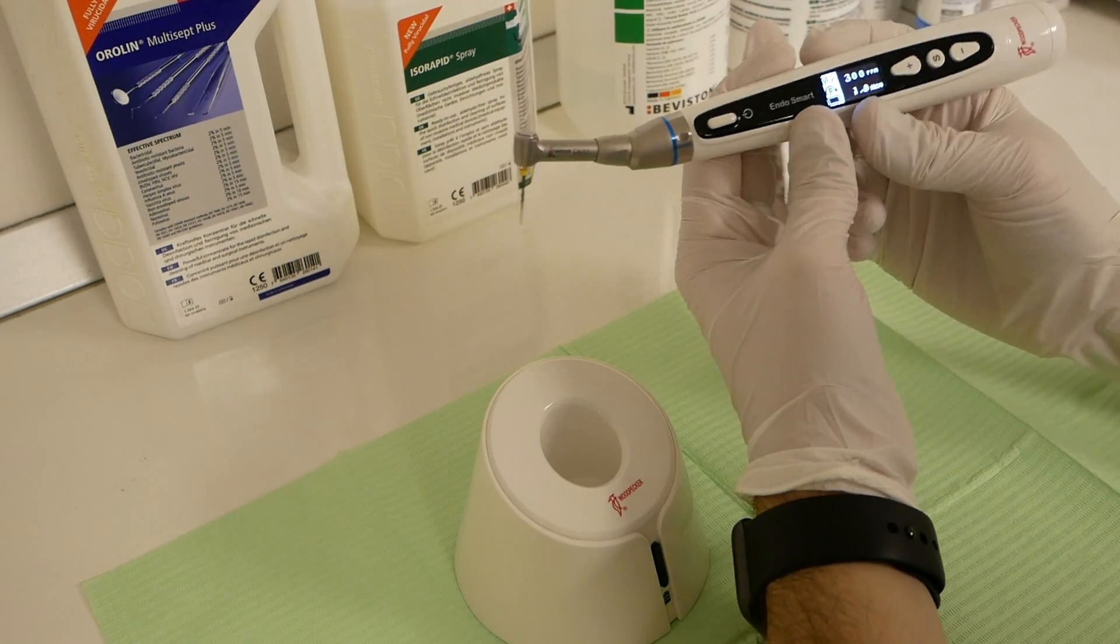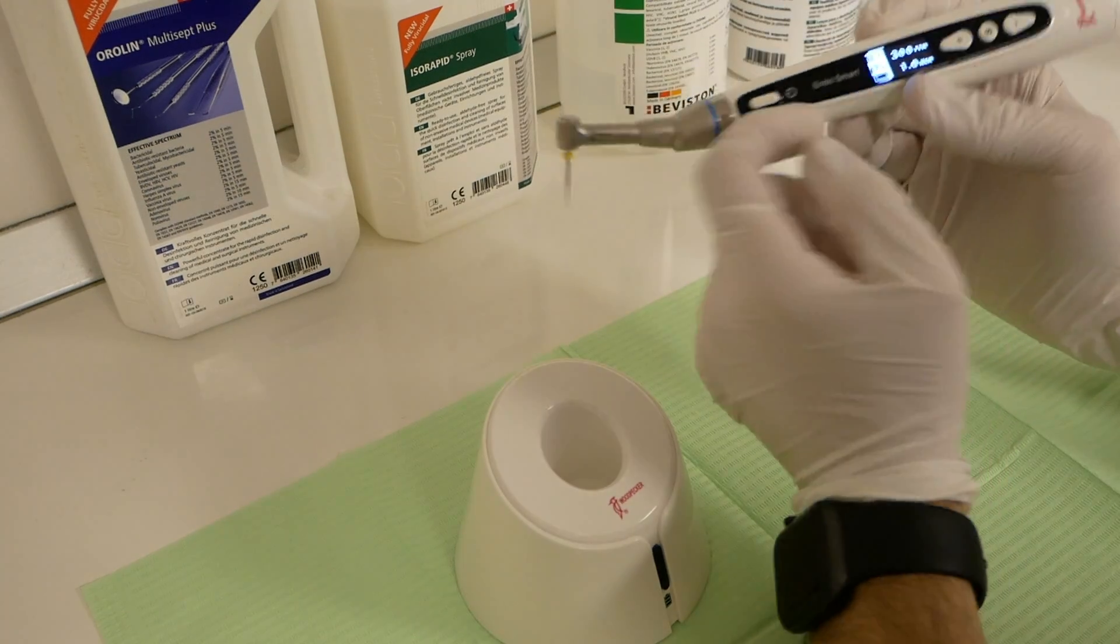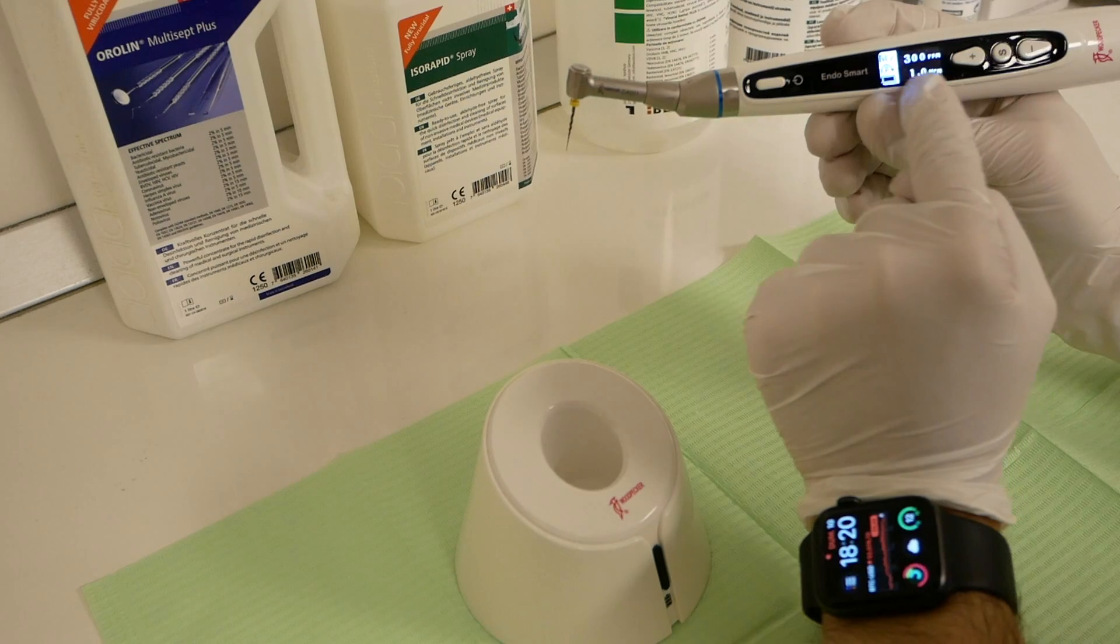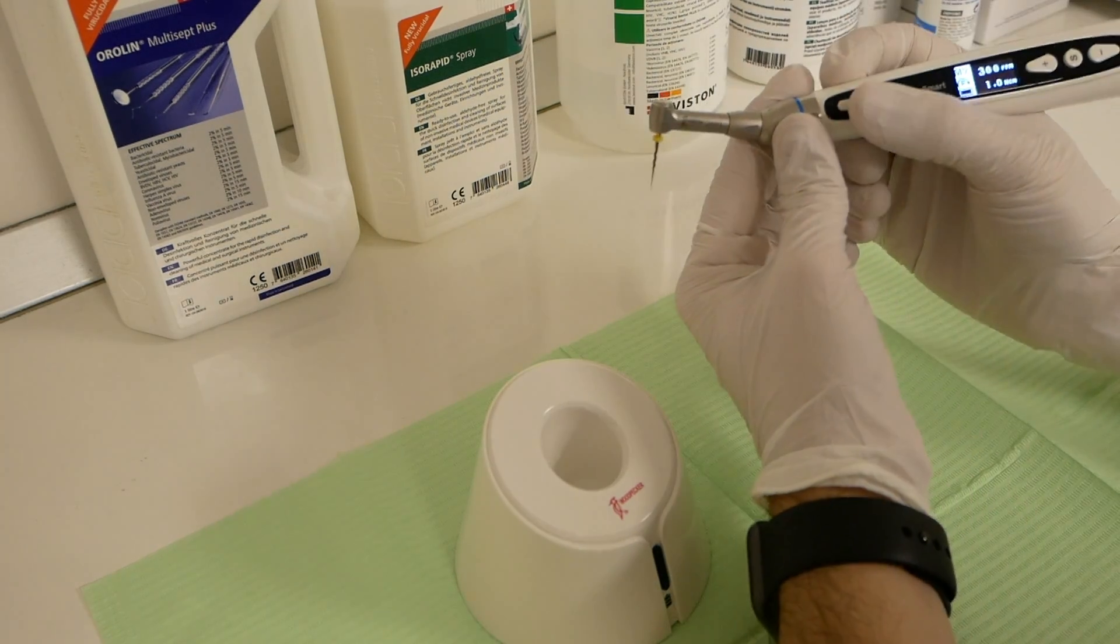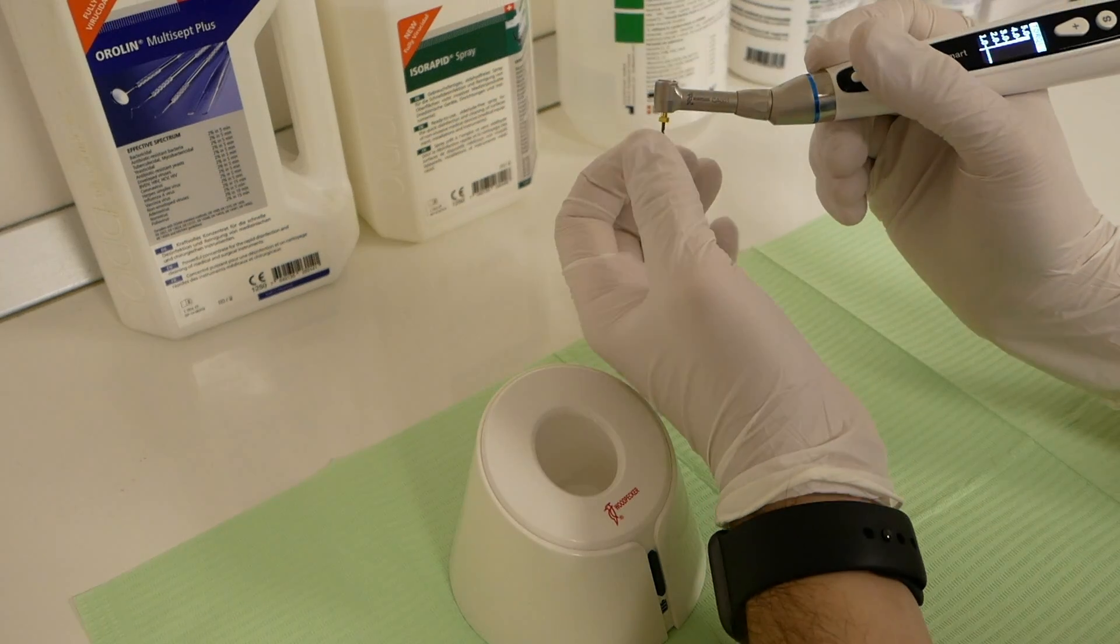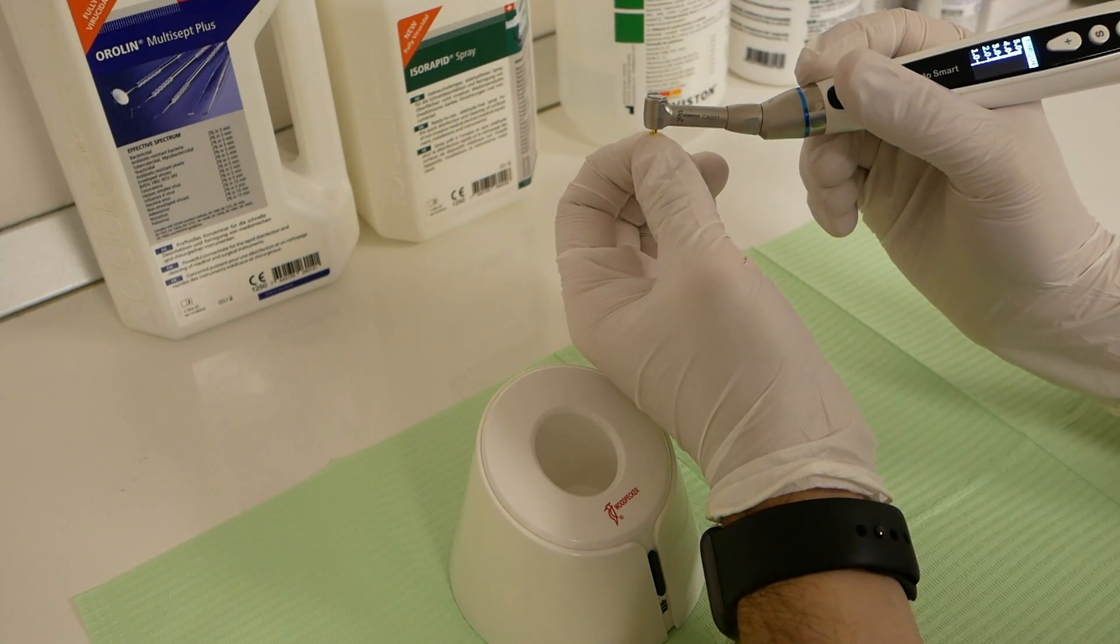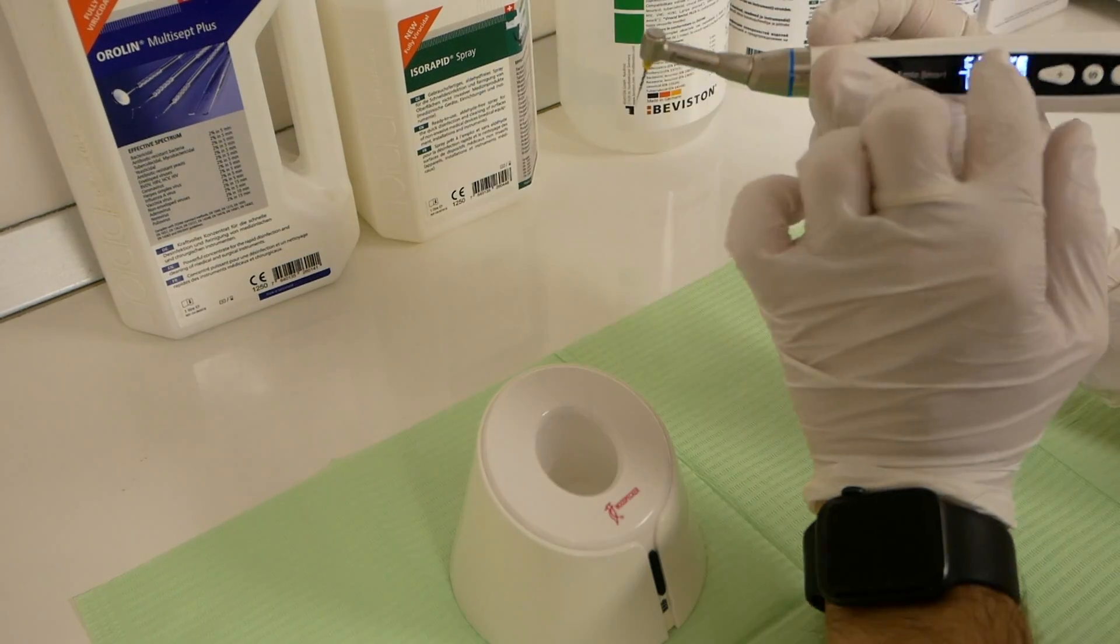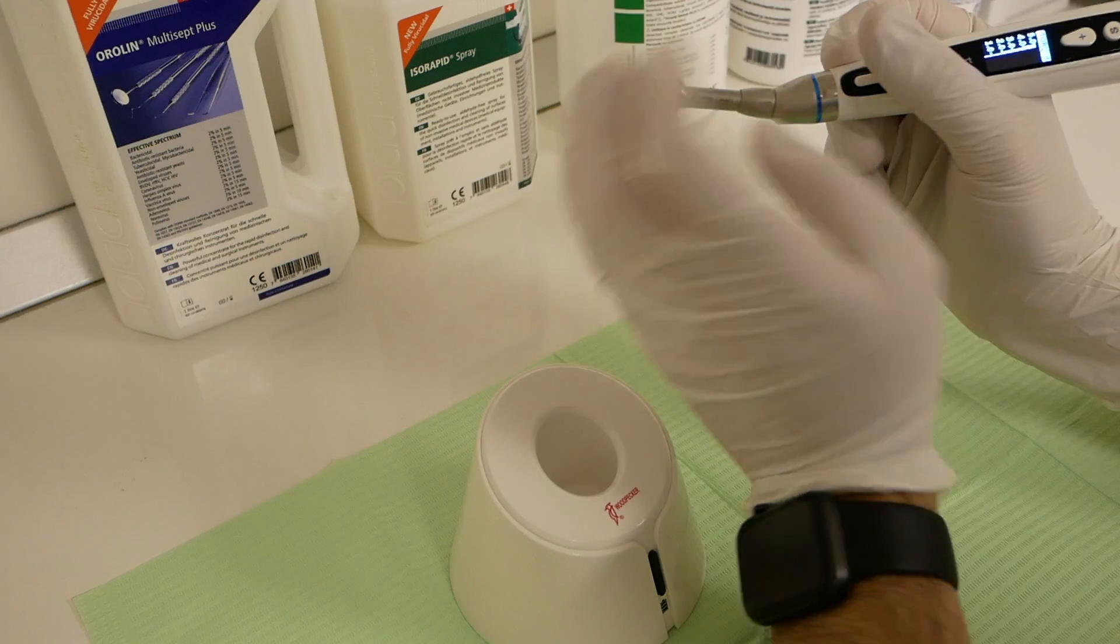That's it. This is program 9: forward motion, 300 RPM, 1 N centimeter of torque. So let's try it. It reached 1 N centimeter of torque. It auto-reversed.